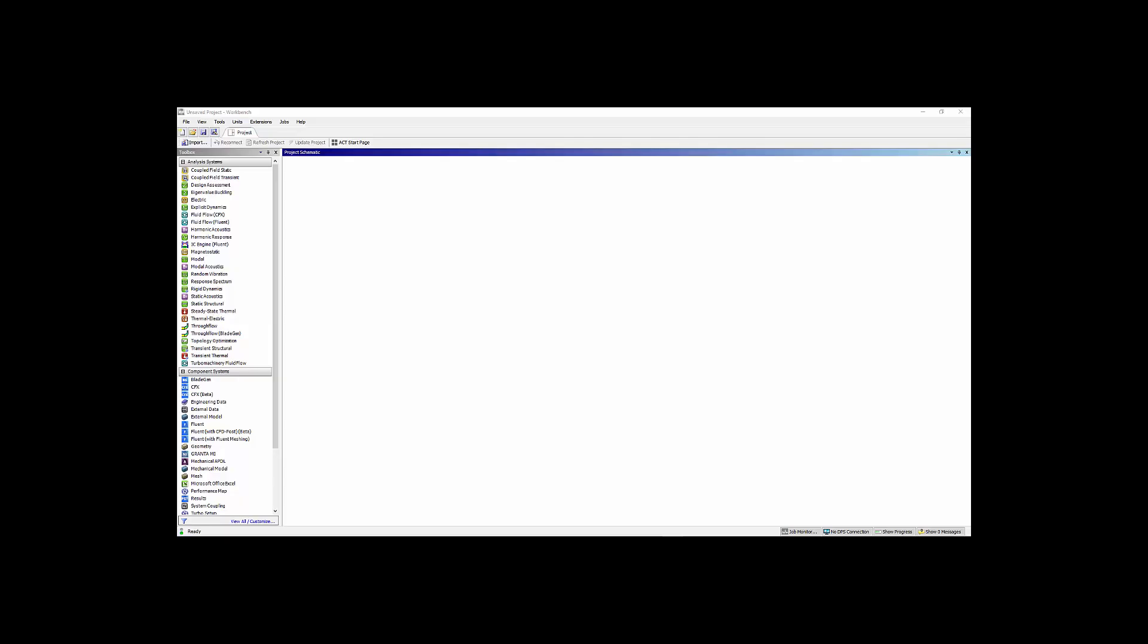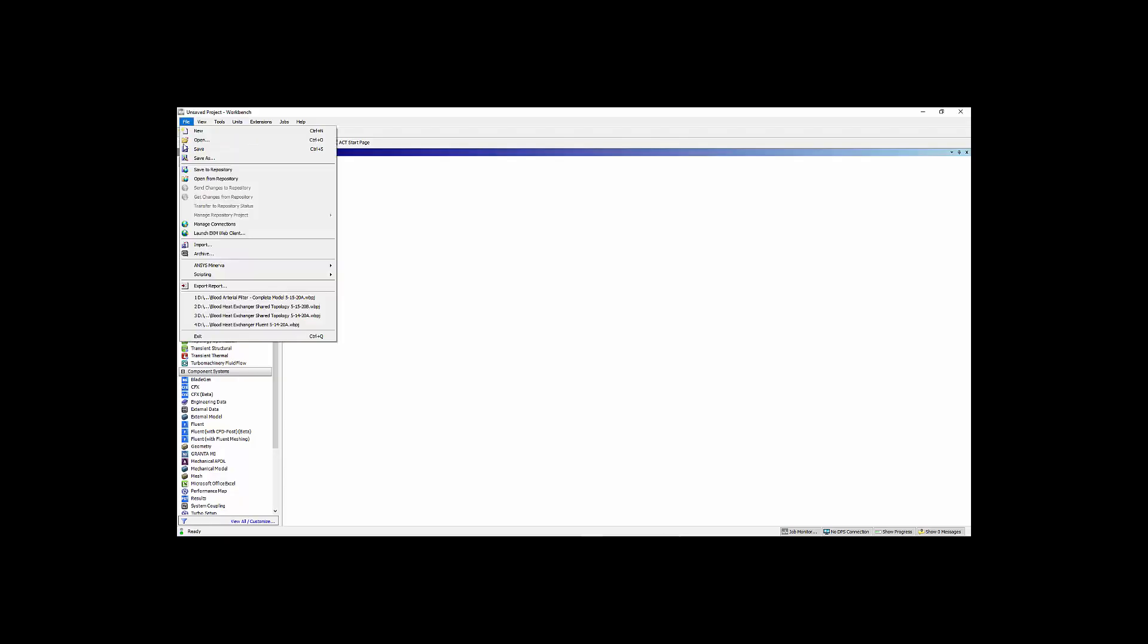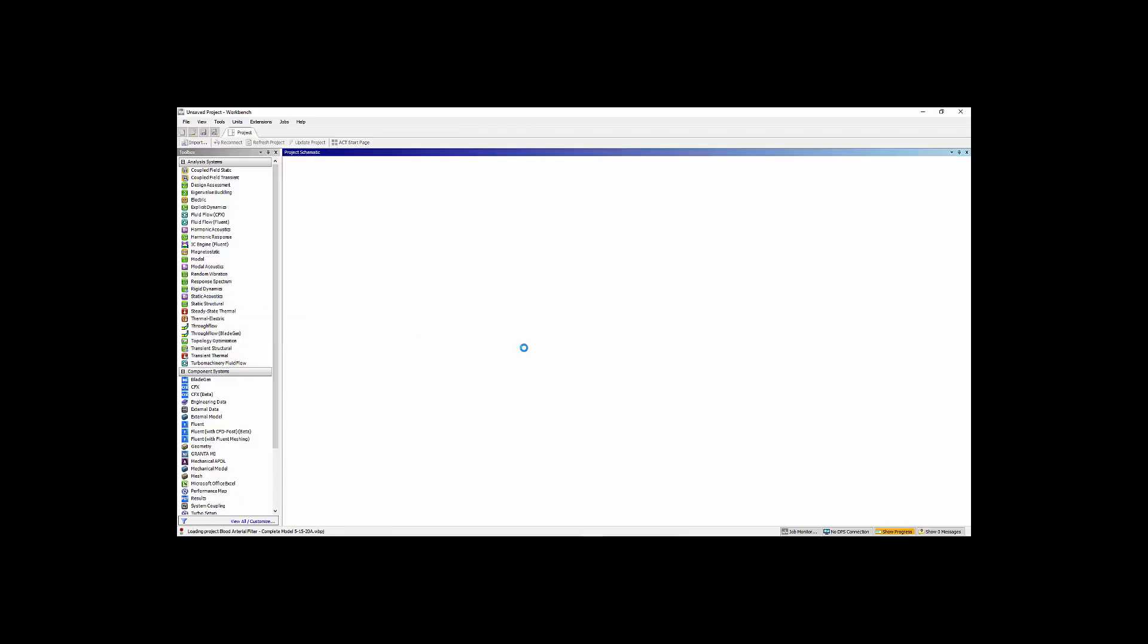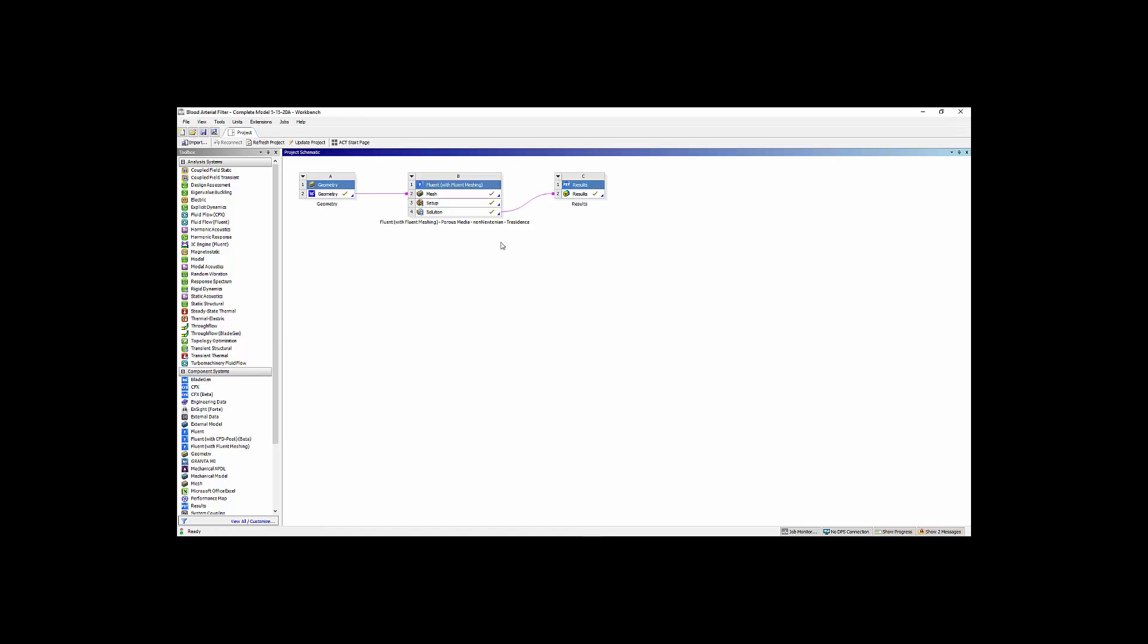So we'll open up Workbench. This is a shortcut I've created. I then go to file and select the file that I just recently completed. This is the model again, that has the complete porous media, non-Newtonian residence time simulation. We're going to double click on the Space Claim geometry component.